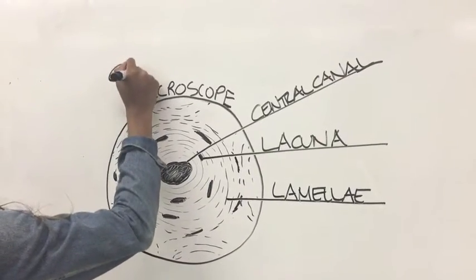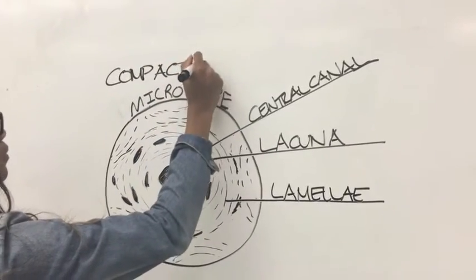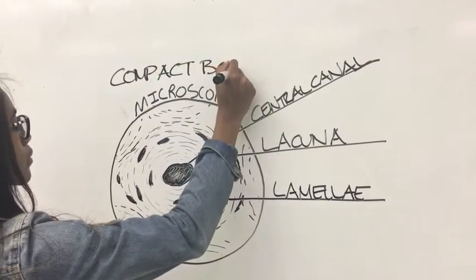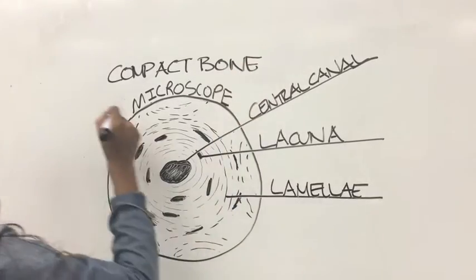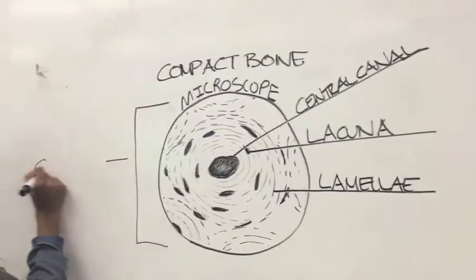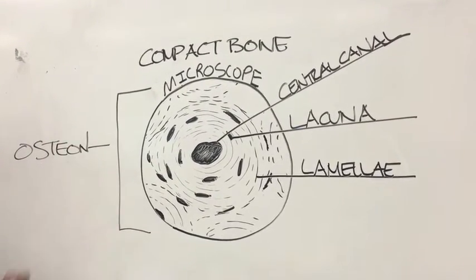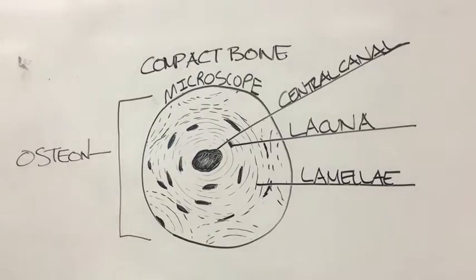Compact bone provides strength and support that forms an outer shell on bones that protects from breaks. It contains many osteocytes located in the lacunae and a surrounding matrix organized into lamellae, surrounding a central canal, ultimately forming an osteon. It is located in the outer portions of all bones and in the shafts of long bones.